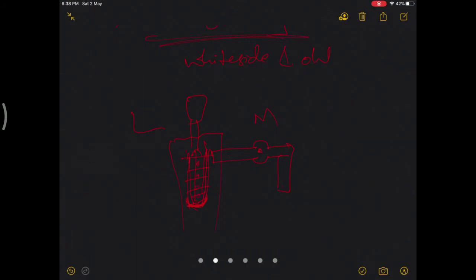You can already drill the screw holes for ease at the end of the closure when you fix this tibial tuberosity fragment, and then with the whole of this, the rectus vastus medialis interval, cuff around the patellar tendon, and along with this tibial tuberosity fragment, you subluxate it to the lateral side to have an excellent exposure.